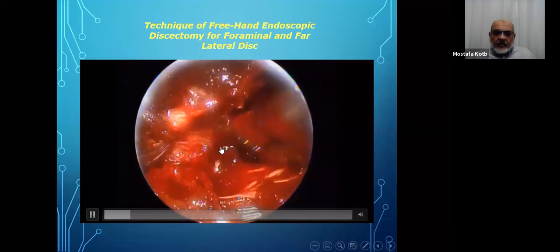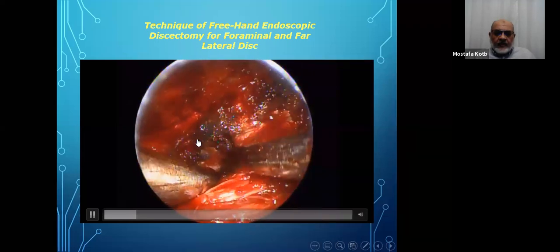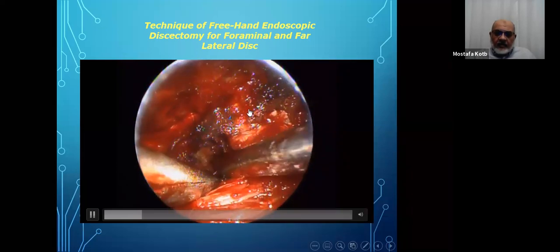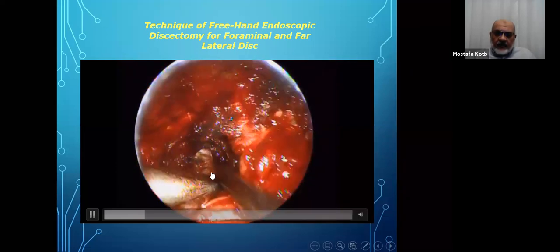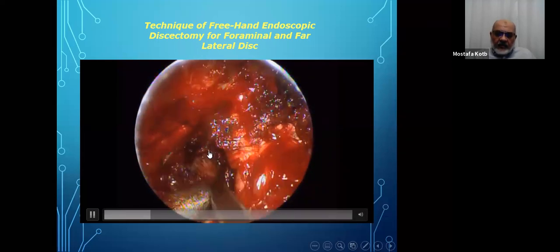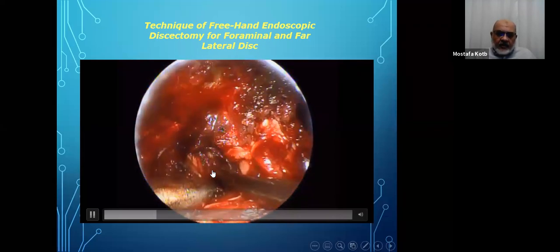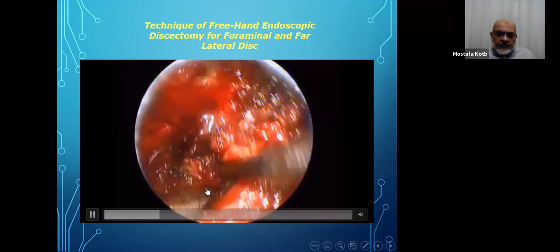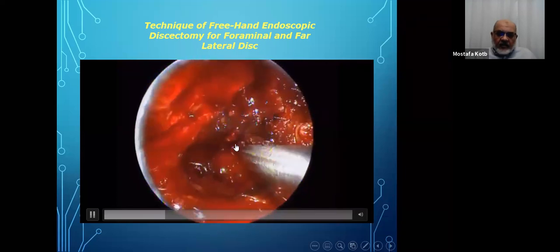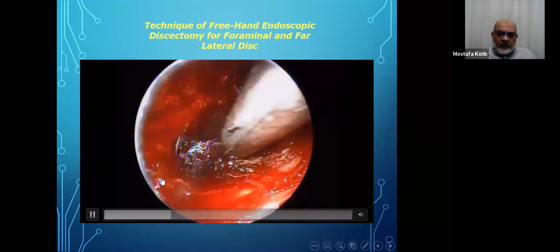Sometimes you have to take a small part of the transverse process and the facet joint to expose the disc space, keeping in mind that you have the traversing root going from up to down in this direction. Here you can see we're exposing the tear in the disc with the dissector. And we start by taking out the disc material with the punches from here.